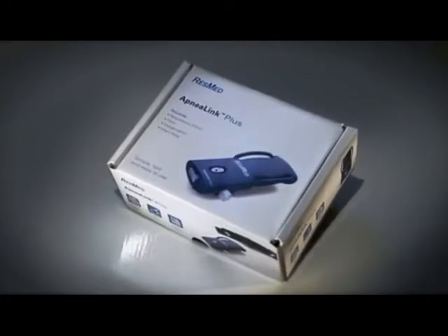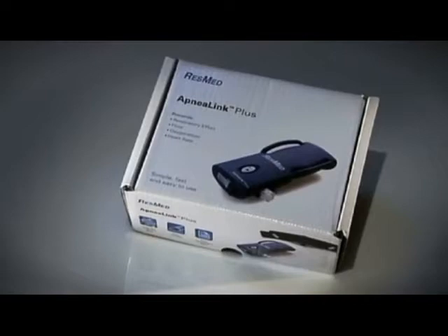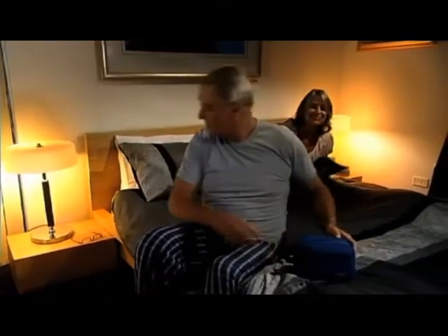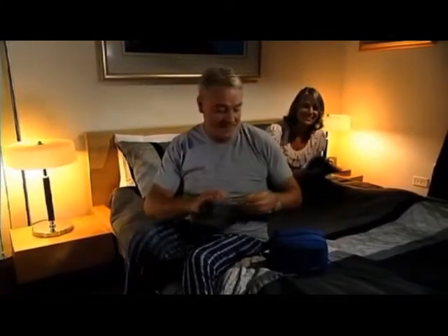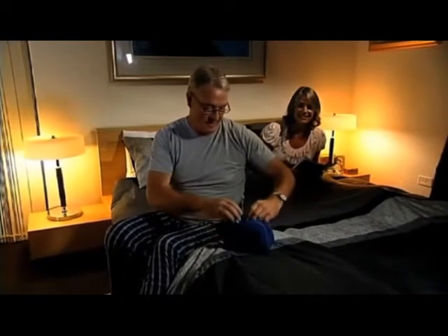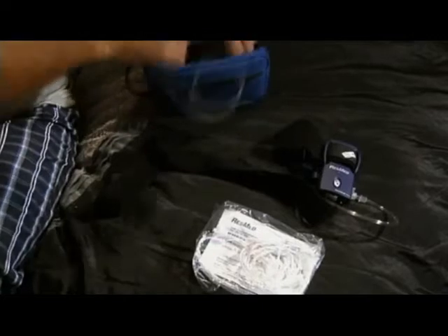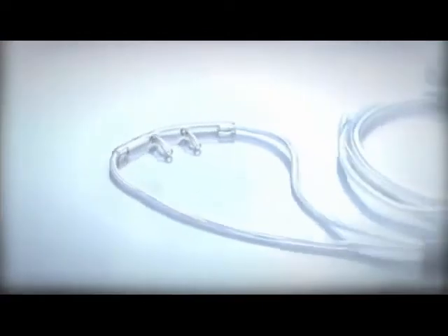That's exactly what ResMed's ApneaLink Plus has been designed to do. These instructions are intended to help you get the most from your use of ResMed's ApneaLink Plus. It will not only familiarize you with the device, it will also help you make sure you use it correctly and efficiently. So let's get started — don't worry, it's simple and doesn't hurt at all.